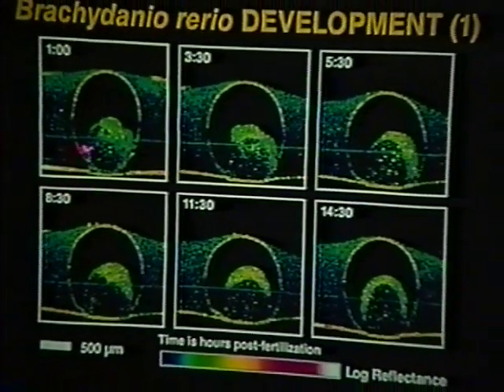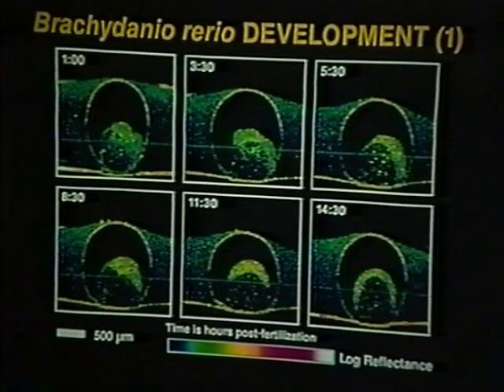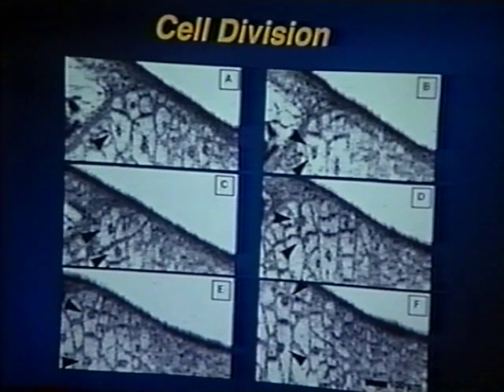Developmental biology is another area of cardiology where OCT has a potential application. Molecular and developmental biologists produce gene abnormalities in some models like zebrafish and xenopus, which cause phenotypic changes which are often difficult to assess. For instance, if you've affected a gene that affects heart contraction, there's no good way of doing that other than sacrificing the animal and therefore losing the gene.